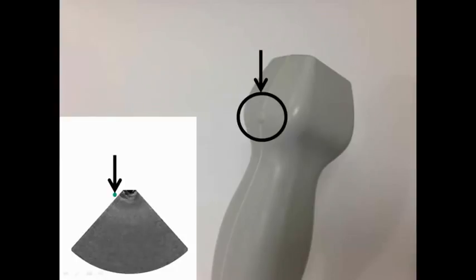Remember also the earlier orientation tool of imagining the probe sitting on top of the screen, making sure that the indicator sides line up. Thinking of the image on screen as what the probe sees when looking down into the tissue may help with orientation. The default location of the indicator for most settings will be on the left side of the screen. For certain exams, including the cardiac exam, however, the screen indicator may be switched to the right side of the screen.